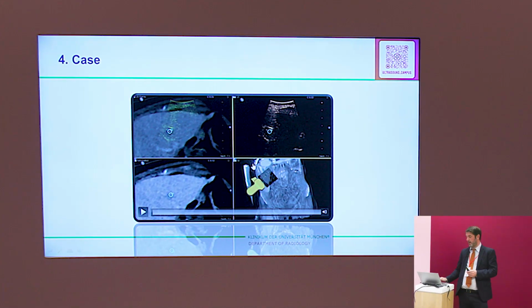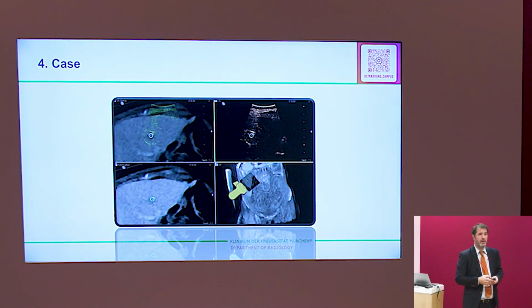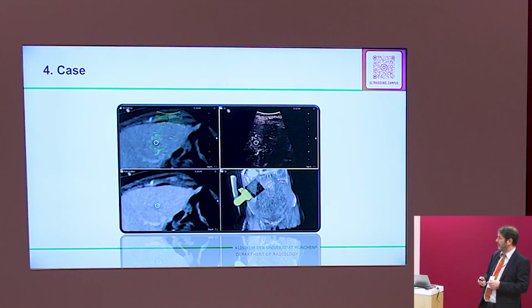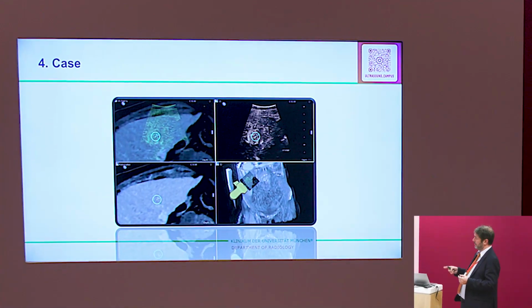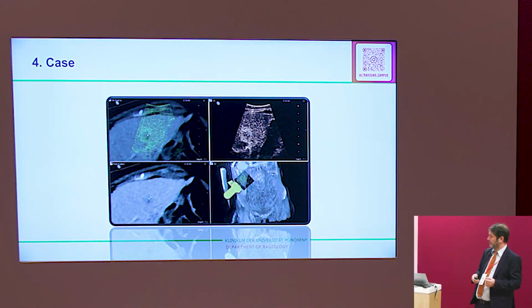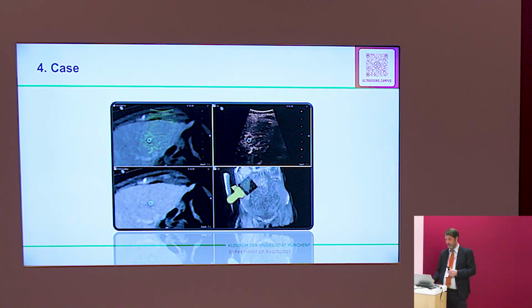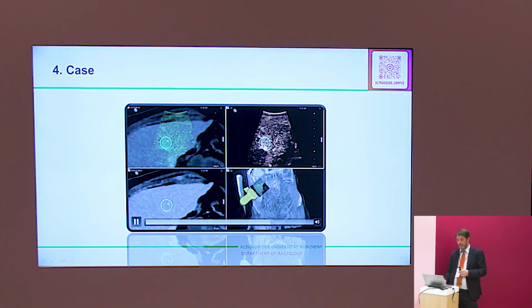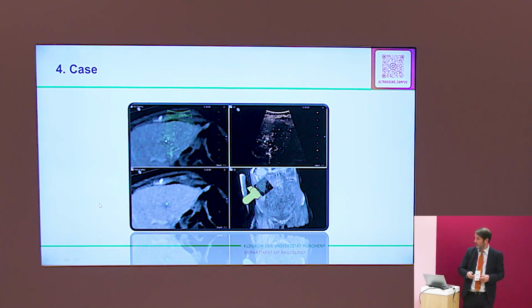This is the area of interest because we have to see how this lesion behaves. Okay, we see a moderate uptake, a little stronger in comparison to the surrounding tissue. But you also see already at the end of this clip that this lesion gets darker in the middle. Do you see this?